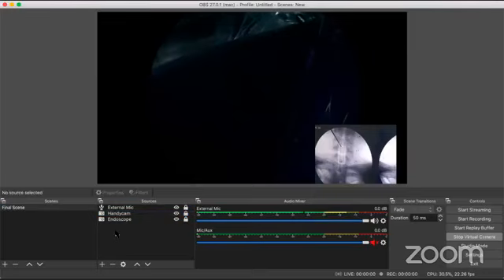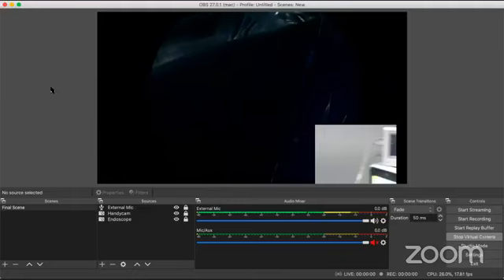So what I'm going to do is I'm going to now mark the lateral facetal line. Shoot, please. Yes, no, this is a little out. I'll come a little further out. Shoot, please. Yes, now I'm on the lateral facetal line. So I'm marking the lateral facetal line. Now, can you please focus here, Miss Shirley? So now she's going to show you what I've done, the marking.